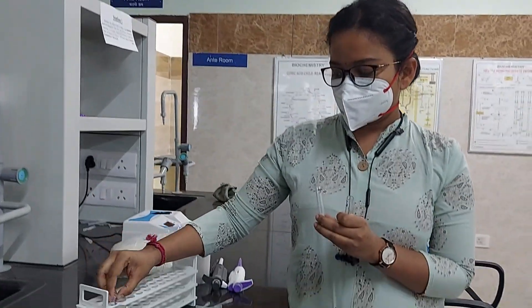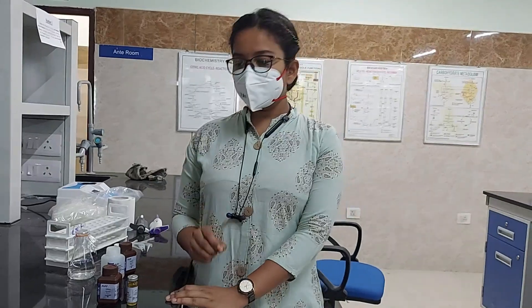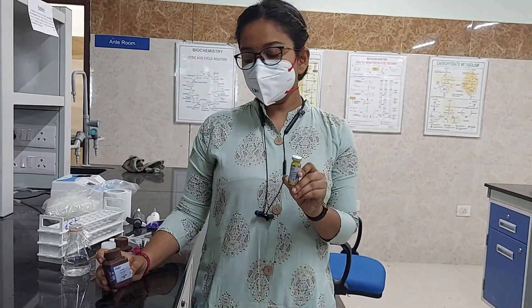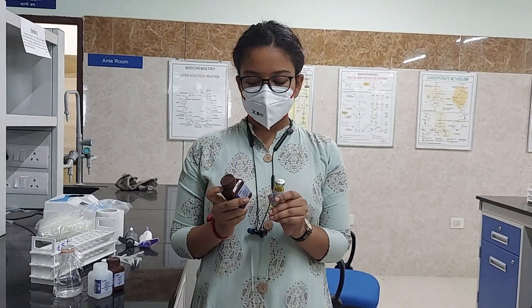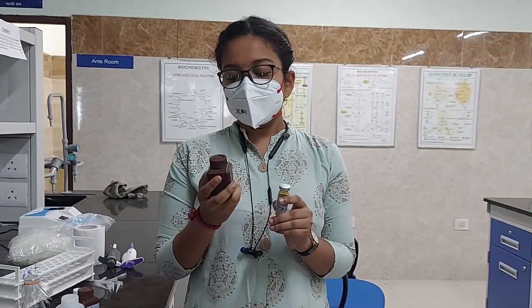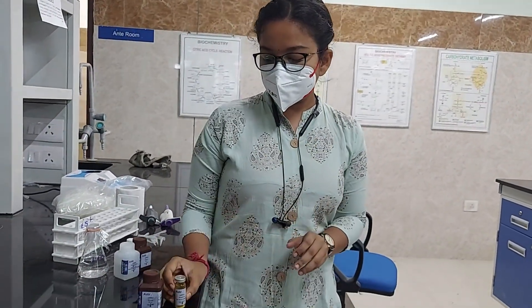We need to mark the tubes first. We have the enzyme kit which comes in a powder form and a liquid form. We are ready to mix it with a measurement of 50 ml to prepare the working reagent.